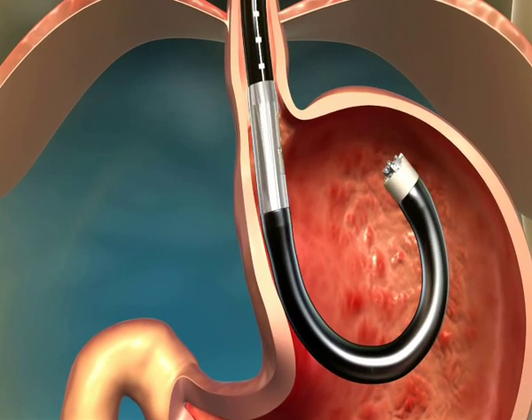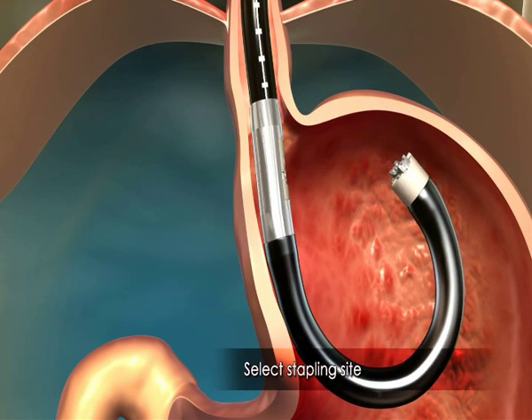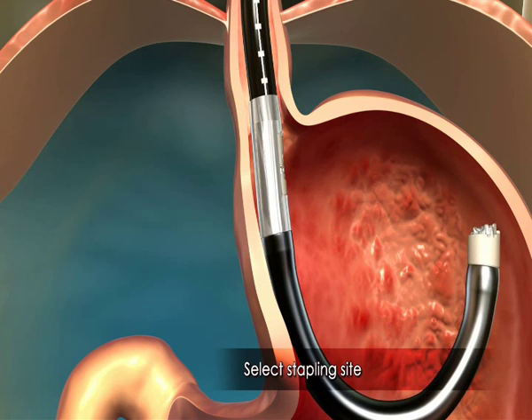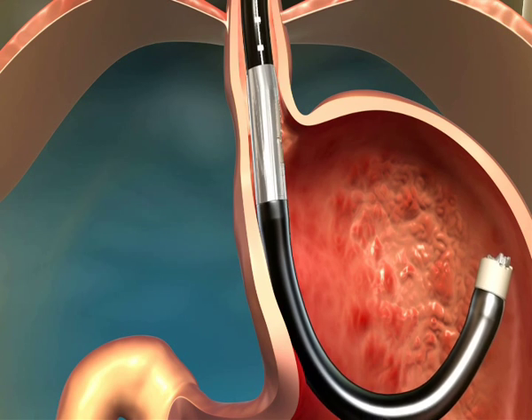Proper examination of the fundus is performed. The plan for the flap is then established. The scope is pushed back to achieve the proper position.